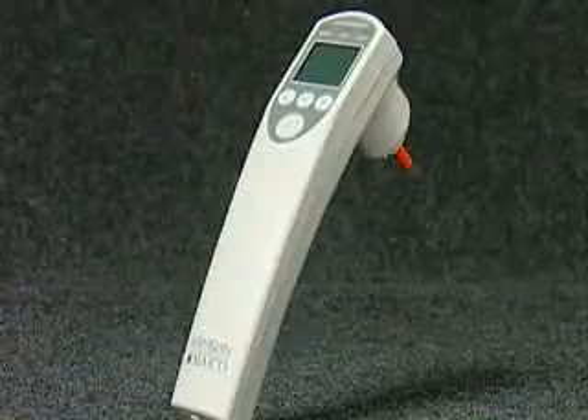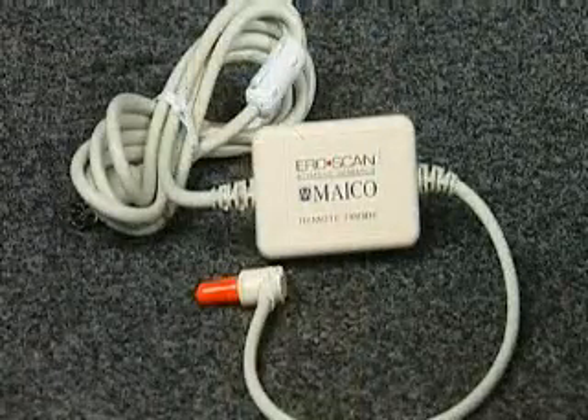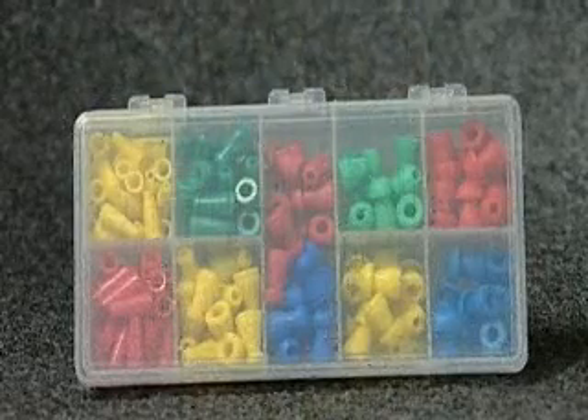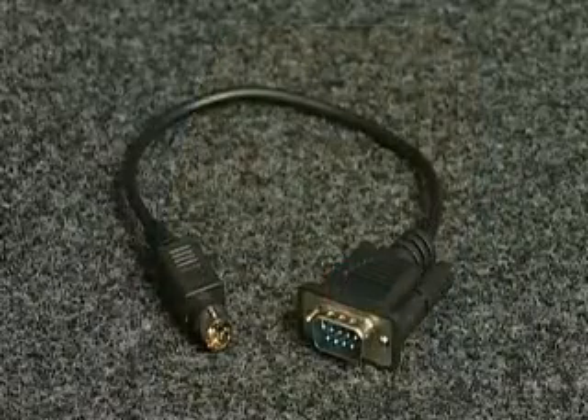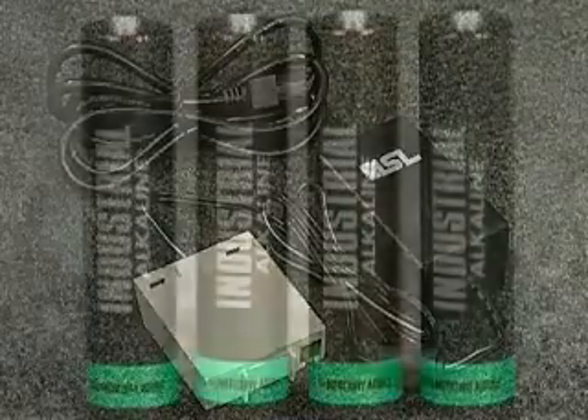The Ero-Scan unit, cradle, external probe, probe tips, ear tips in 12 sizes, printer, printer cable, thermal printer paper, power supply, batteries, and manual.